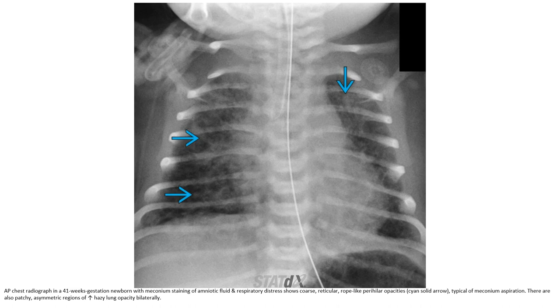This radiograph in a 41-week gestation newborn with meconium-stained amniotic fluid and respiratory distress shows coarse linear rope-like branching high-density opacities typical of meconium aspiration. There are also patchy asymmetric regions of heterogeneous lung opacity bilaterally.